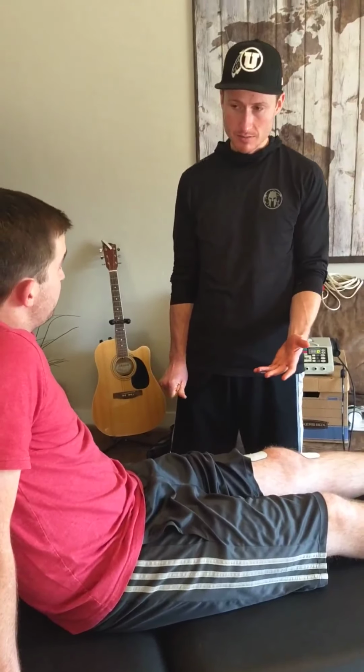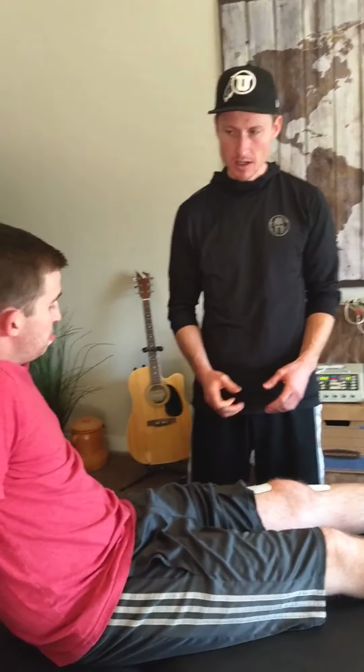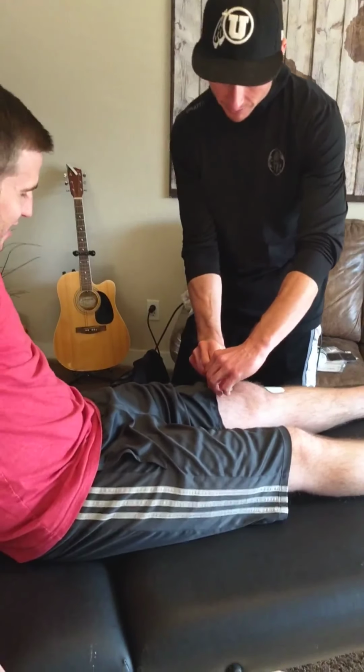Hank, how was that application? Did it feel okay? Any pain or any? No pain, it felt good. Yeah. Did it? Yeah. Okay, any questions for me regarding any of it? I don't think so. No. Okay, great. Okay, so I'm just going to pull these off gently. Try not to take out all of your leg hair. Yeah, get the band-aid, right?